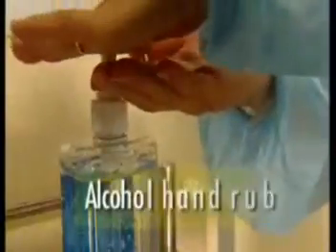When using an alcohol-based product to perform hand hygiene, dispense the recommended amount onto your hand and rub the product over hands and between fingers, ensuring all surfaces are covered. Allow the product to dry completely.